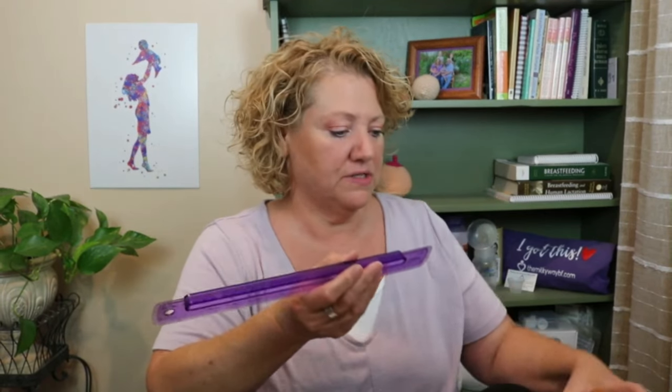To check what flange size you need, measure your nipple in millimeters from side to side. A really easy trick is to compare your nipple to a coin: a dime, a penny, a nickel, or a quarter. This one is closer to a nickel, probably more like a quarter — it's a larger nipple — and that tells you the size of your nipple so you can find the right flange size.